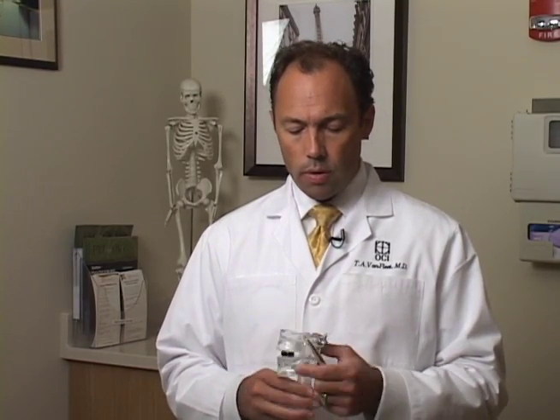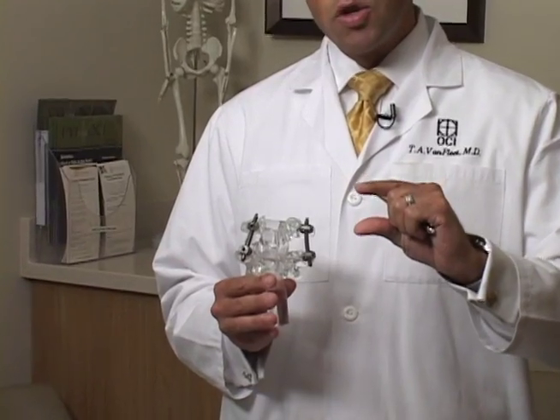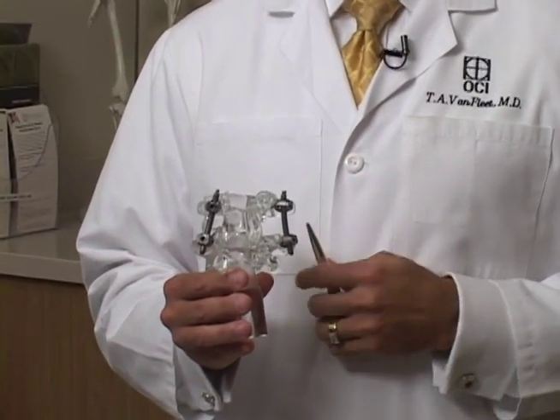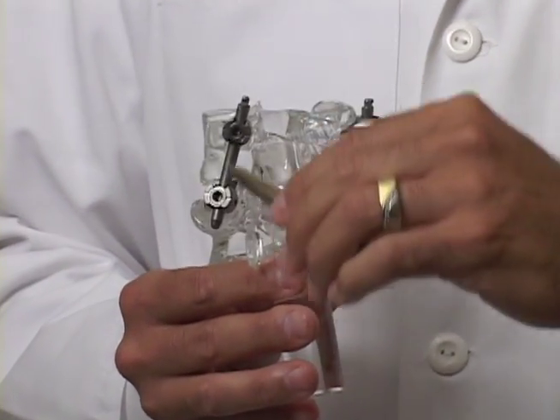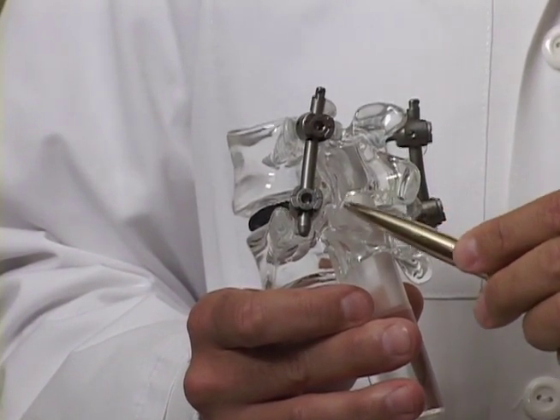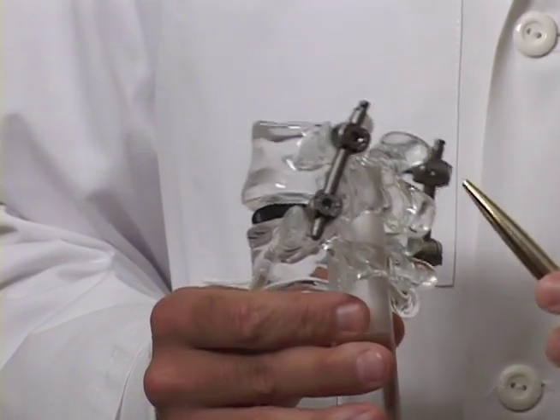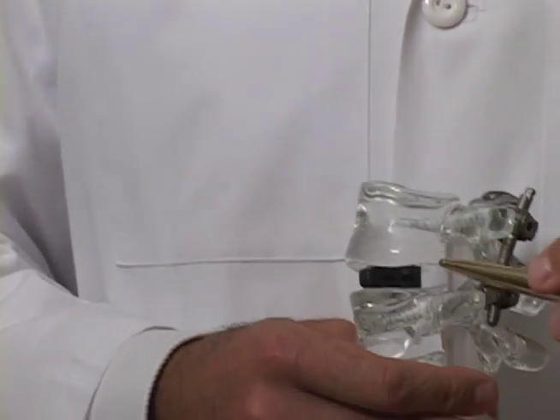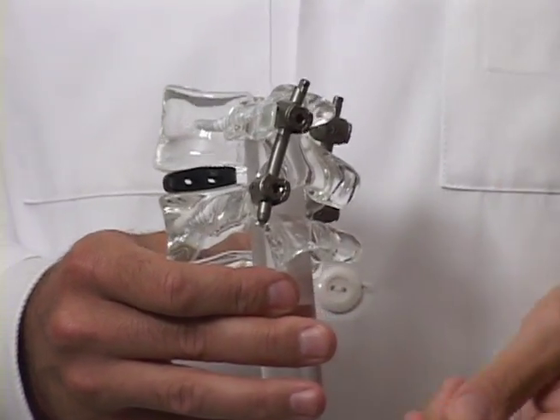We make two separate small incisions, each about an inch in length, one on each side. The incisions are centered over the paraspinal muscle groups. We come down through the facet joint, which exposes the foramen where the nerve root sits. As we expose the nerve foramen, the approach is called the transforaminal approach because we are working through the nerve tunnel.